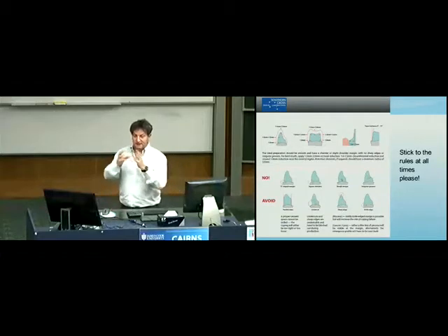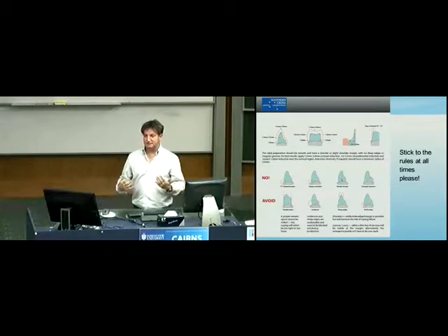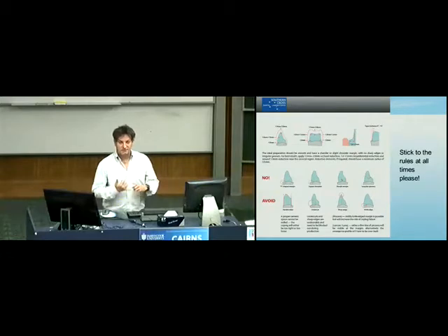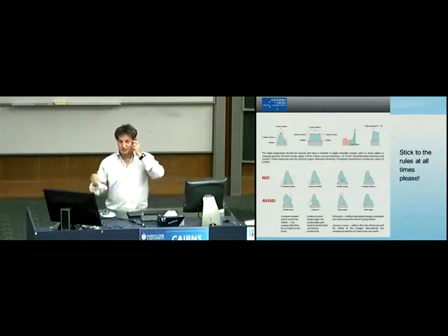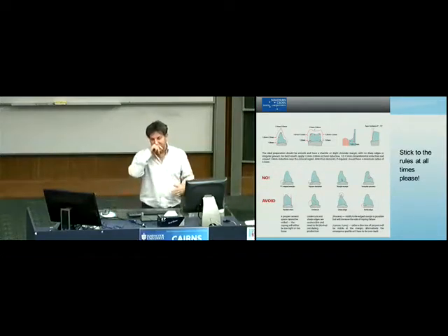Now, when that little Duralay pattern comes back and you slide it onto the abutment and you've got the belly hanging out, you think, geez, why didn't I reduce that? So when you reduce that, should you reduce just the right amount or maybe a little bit more? What's your feeling on that one? Obvious. You should always do perhaps a little bit more. It's very difficult to get that right. What's it going to be filled in with anyway? Cement. And most of the cements are made up of what now? Composites. So we've got a basically flowable composite which is filling that gap in. You just got to hope that that's not in a stress-bearing area if you possibly can.